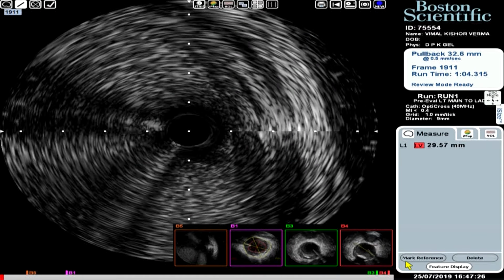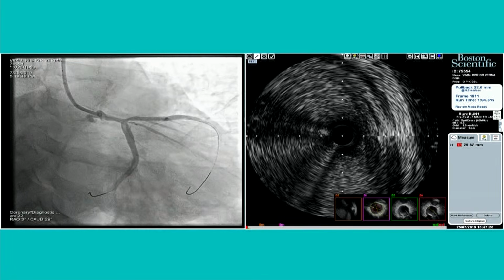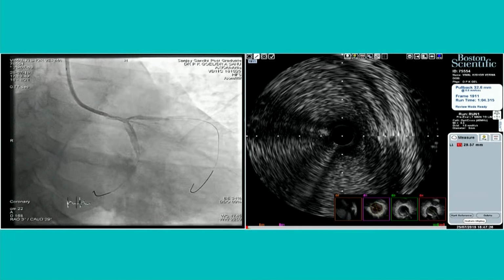So with that type of disease, because the circumflex angiographically, you can see how the circumflex looks after this. Another important aspect of imaging is to assess the ostium of the left main, how it relates to the LCX. If it is diseased, then you would plan to do a withdrawal IVUS from the circumflex also. We've just done it from the LAD. Can we see this angio better? Somehow, if you see the angio, it looks okay. It seems that the circumflex is big and it is okay.